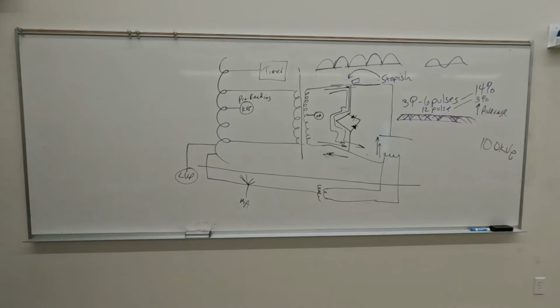So we talked about self-rectifying tubes, we talked about single phase, 100% voltage ripple on both of them, full wave and half wave rectified units. We talked about 3-phase, overlapping pulses, rectified, you can get 6 to 12 pulses, 14%, 3%, less than 1% in high frequency. So it's near constant potential. Okay, capacitor discharge units. Again, something that probably should come off the registry.